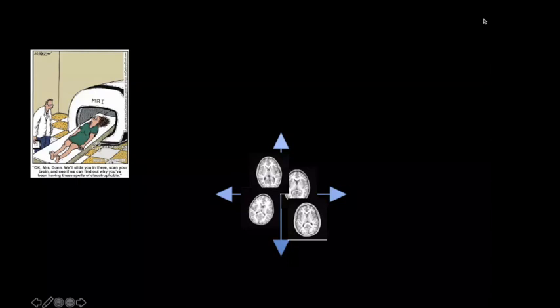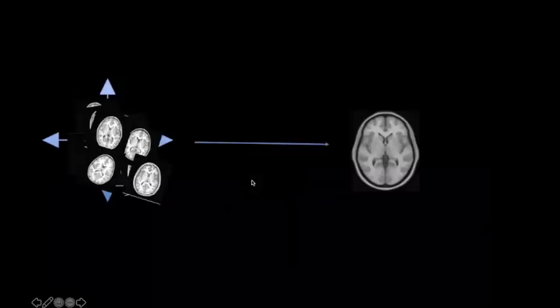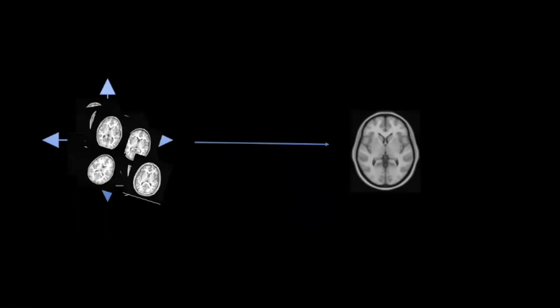Just one second here. So once you have all the images that you want to acquire, you acquire a lot, then you create some sort of mapping between each of these images, each of these three-dimensional cubes or blocks, towards this common space, like MNI space that's been created for you. There are ways to do this within the population itself, but we're not going to go into that too much today.